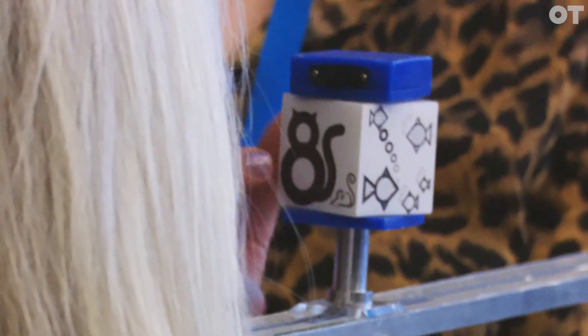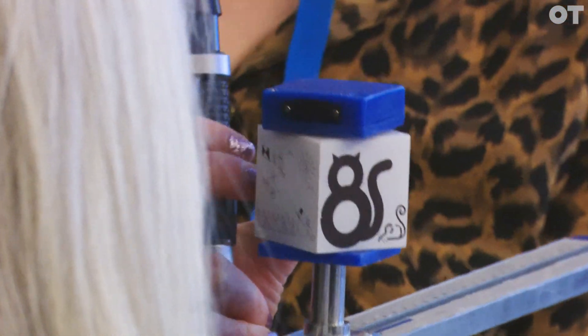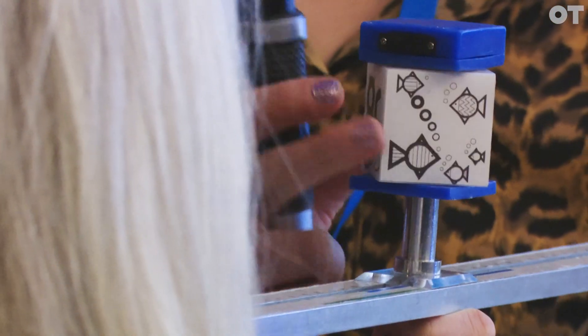This is the Ulster-Cardiff cube. Essentially you've got a target and we have a variety of pictures, or you can change it to have letters and numbers for an older child or an adult. There are lots of different degrees of detail in the different pictures, so for a young baby who has poor vision you'd maybe use the bullseye target, but for most of my patients I'm using a more detailed target.